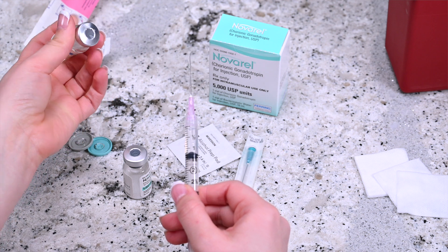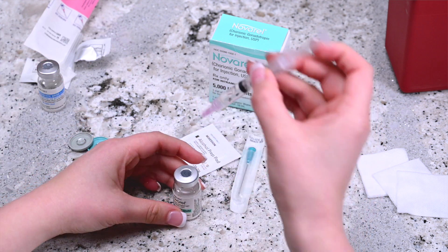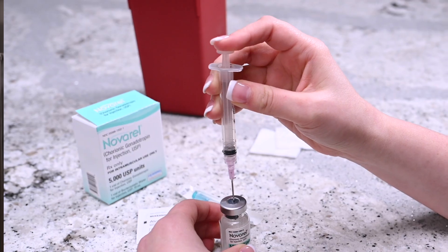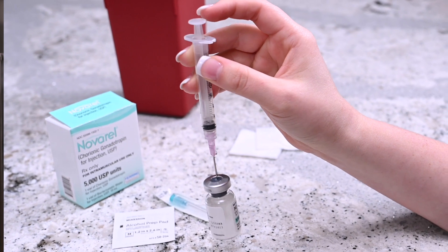Remove the needle from the vial and place it into the vial of Navarol powder and release the solvent by pushing the plunger. Mix the contents of the vial by gently swirling the vial until all the powder has been dissolved.